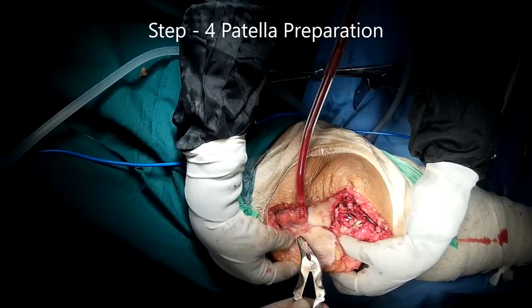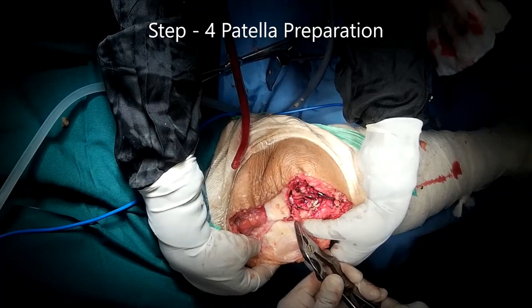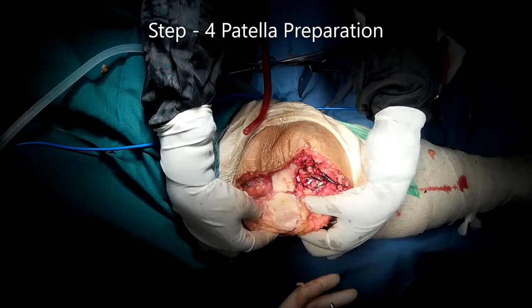In this case we are not going to replace the patellar component, so we are going to excise all the osteophytes around the patella and do abrasion chondroplasty of patella.